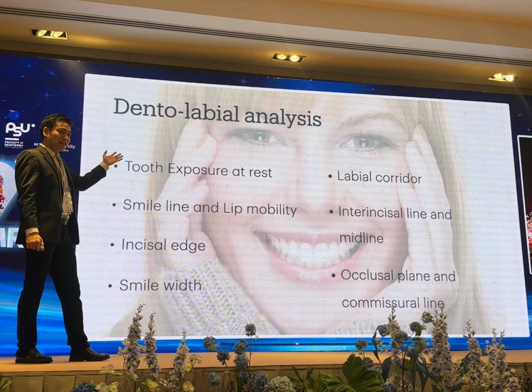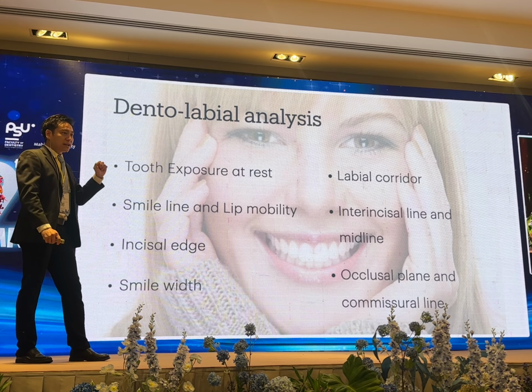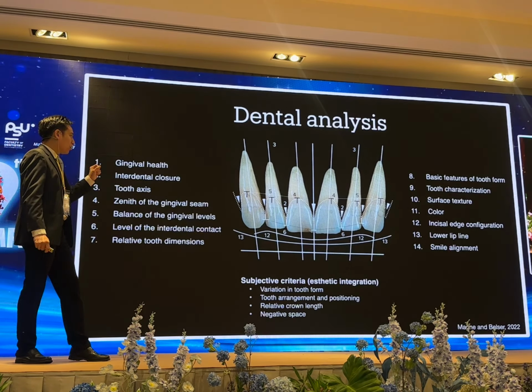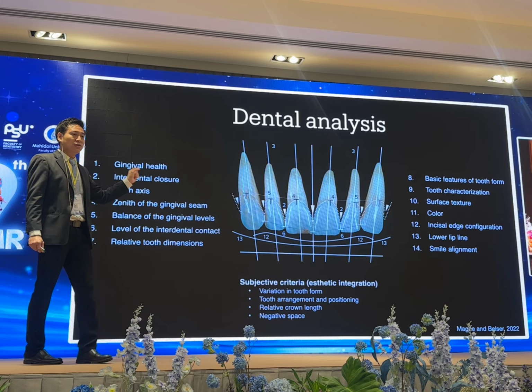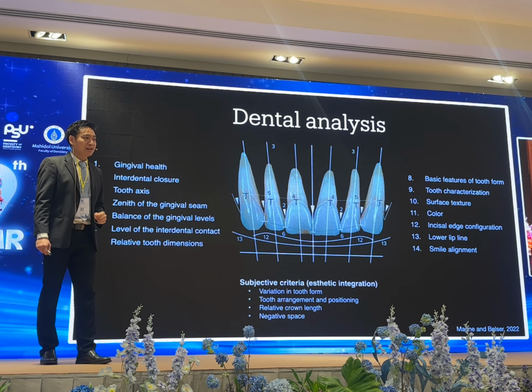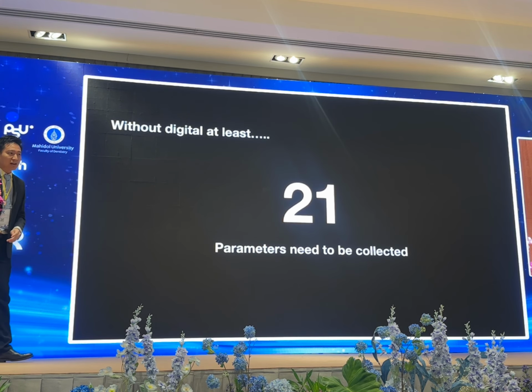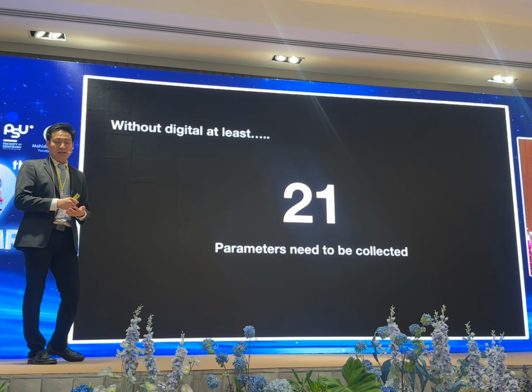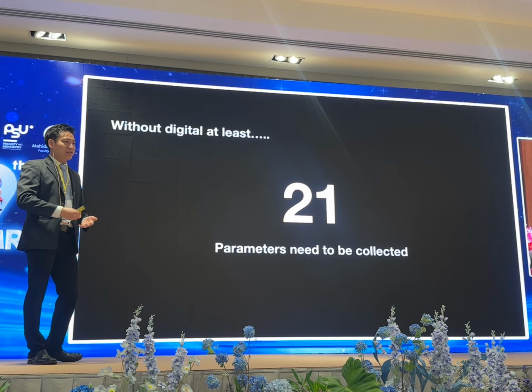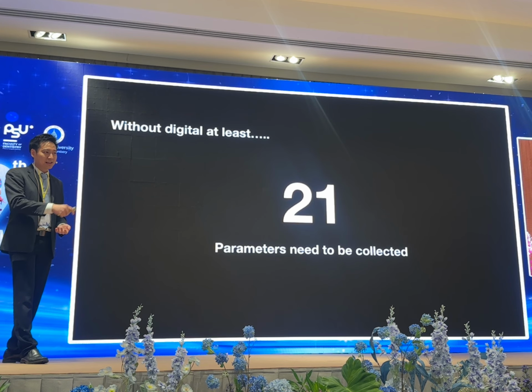This is for just the extraoral and the teeth parameters that relate together. But if you open the patient's mouth and take a closer look, you have around 14 parameters you have to collect. So without digital technology, you need to collect at least 21 parameters to be registered into your information and make it correct.